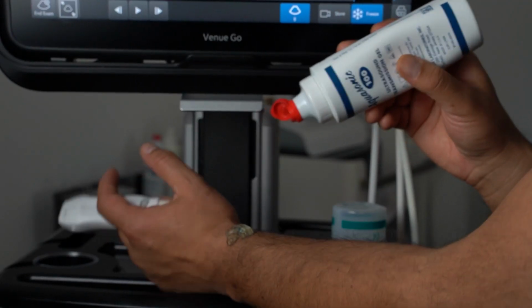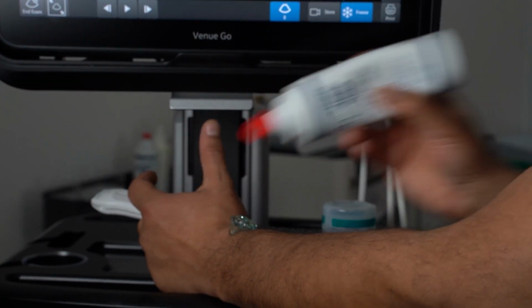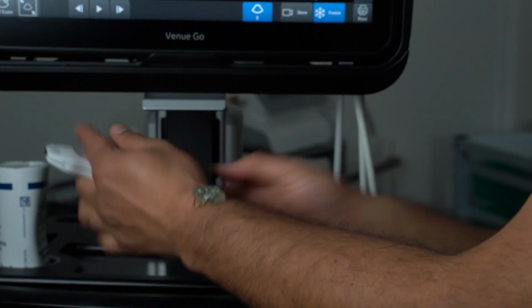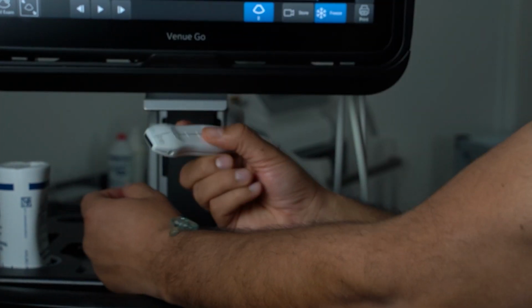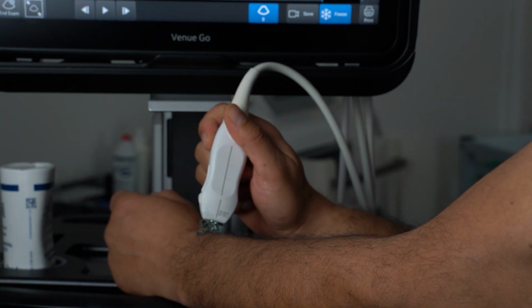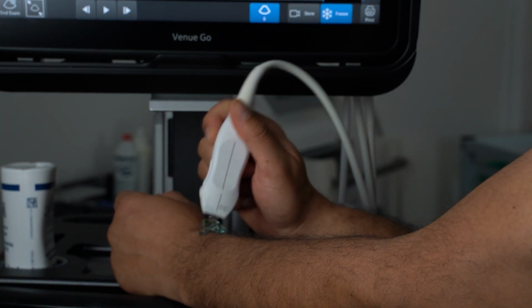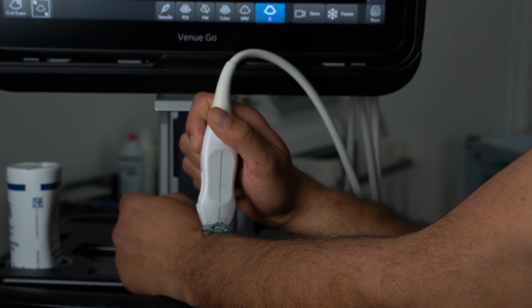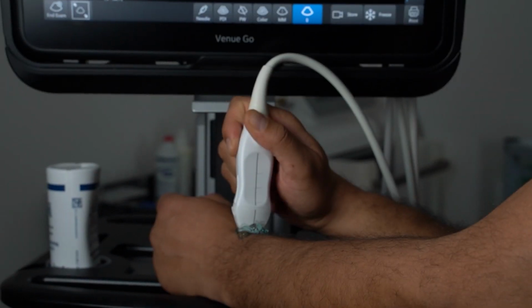I'm going to do a quick demo and just show you a quick idea of how ultrasound is used and how it can be used in clinic, and very, very quickly. Okay, so this is ultrasound gel being applied, and that allows the signal to be transferred from the ultrasound probe, which is this device. There are lots of versions of the probe available. This is a very high definition one. It's very good at looking at superficial tissues and soft tissues.